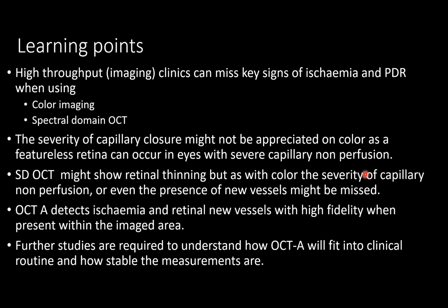At the moment, we don't really understand absolutely everything about OCTA, but with COVID, we also found that we wanted to keep the patients in clinic for a shorter period of time, not wanting to do as many fluoresceins as we might have done otherwise, and with the patients appreciating that they don't have to have fluorescein angiography, we are doing more and more of this technique, and of course, we are learning more and more about it.